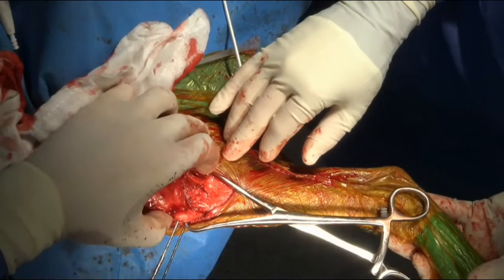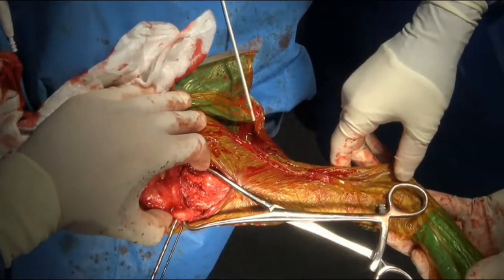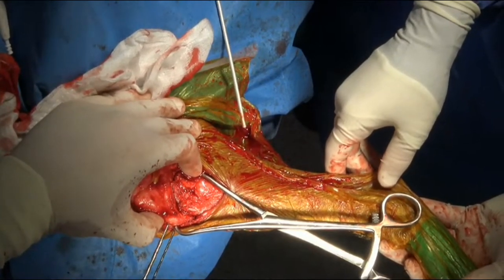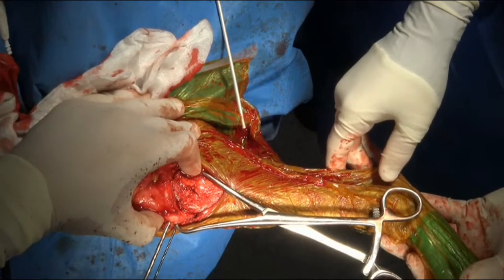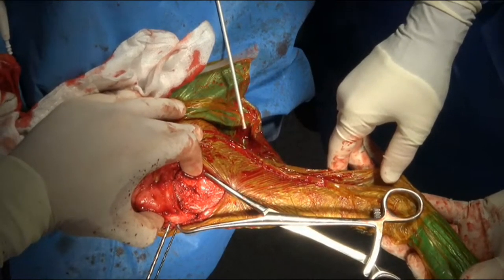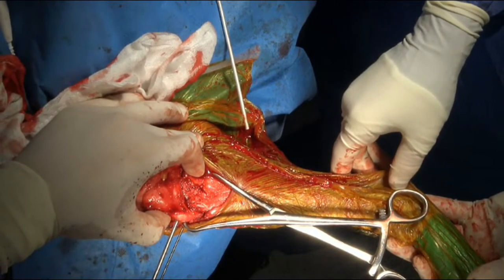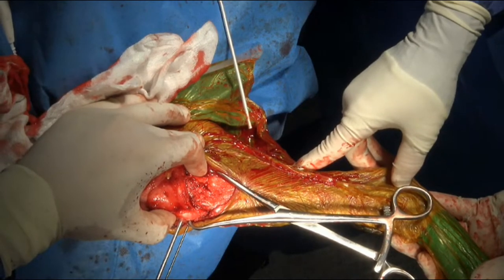You would think you don't want to try and damage that at all. One of the key things when we're using these cannulated drill bits is just to run the drill backwards and forwards on the pin and make sure it's sliding really nicely. We don't want to start drilling this on an angle because we'll actually break the pin. The other thing I'll do as I drill this is just drill it in stages. So I'll drill the first bit. And I'm going to get some saline on there as well, Ari, please.